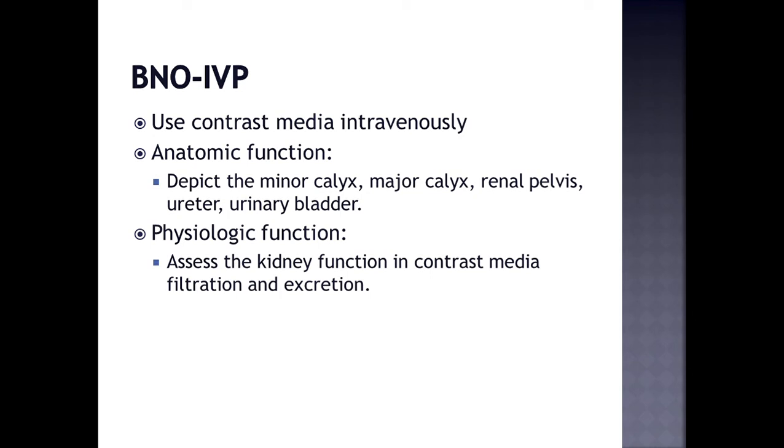So that is about plain X-ray. Next, we talk about the modality intravenous pyelography. In intravenous pyelography, we use contrast media intravenously, and it helps in depicting both anatomic as well as physiologic function. In anatomy, it helps to depict the minor calyx, major calyx, renal pelvis, ureter, and urinary bladder. And in physiology, IVP is a wonderful study to assess kidney function, including contrast filtration and excretion.